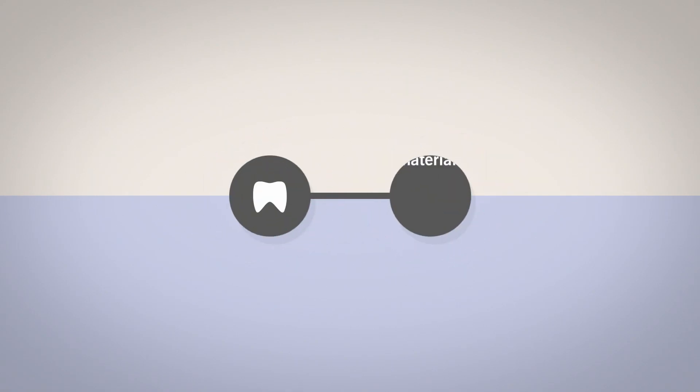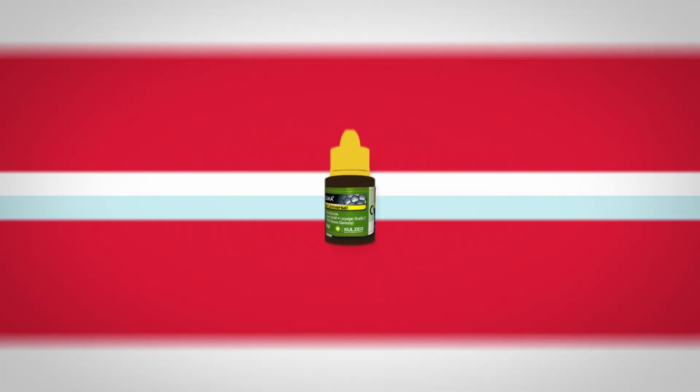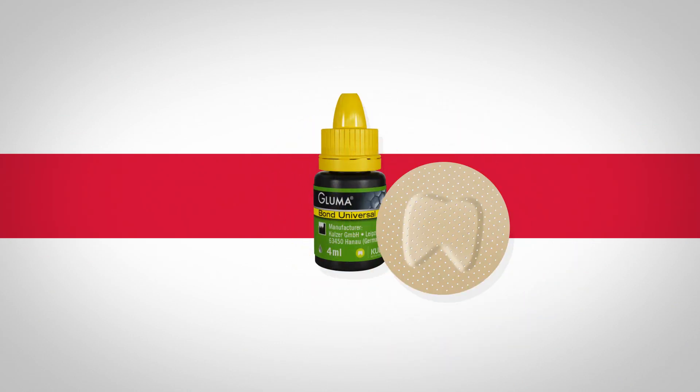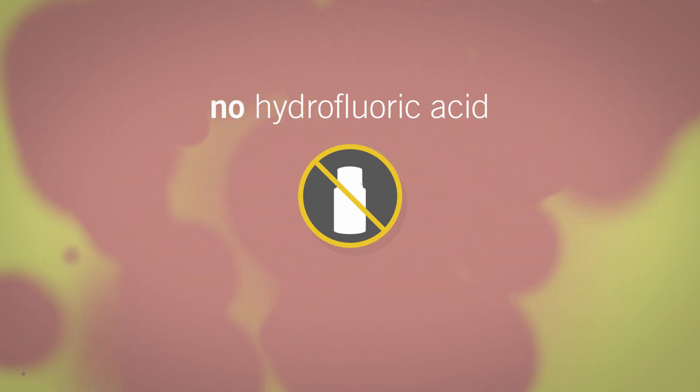GLUMA Bond Universal provides reliable and long-term bond strength with all dental materials. Your assistant won't accidentally mix up different bonding kits. GLUMA Bond Universal works on most materials with just one bottle. Only on silicate ceramic surfaces does GLUMA Ceramic Primer have to be applied intraorally prior to the adhesive, so there is no need to use the hazardous hydrofluoric acid in the patient's mouth.